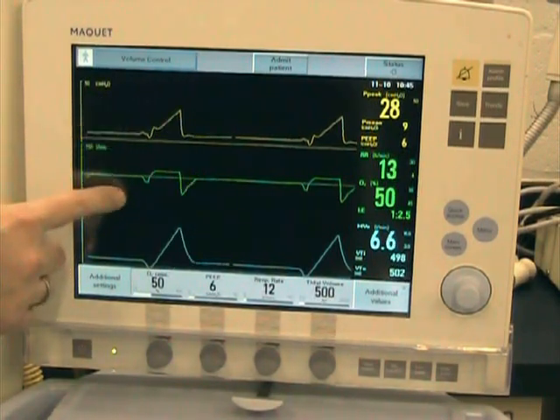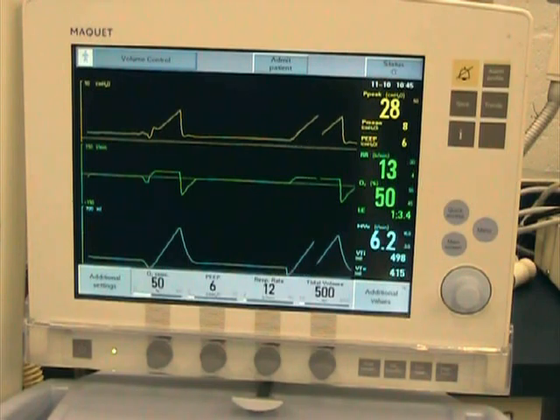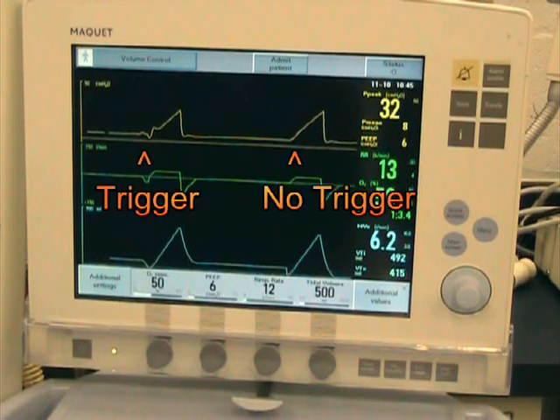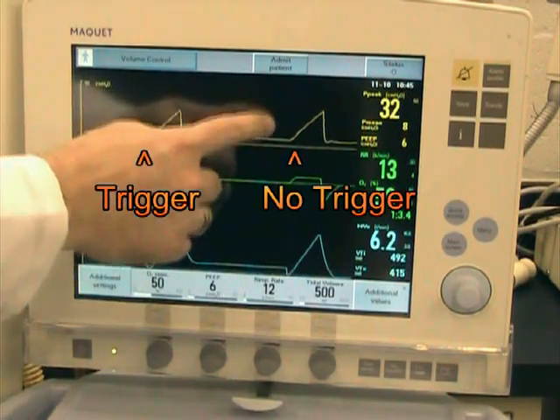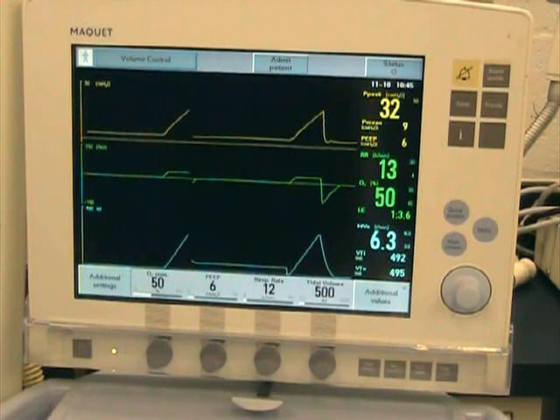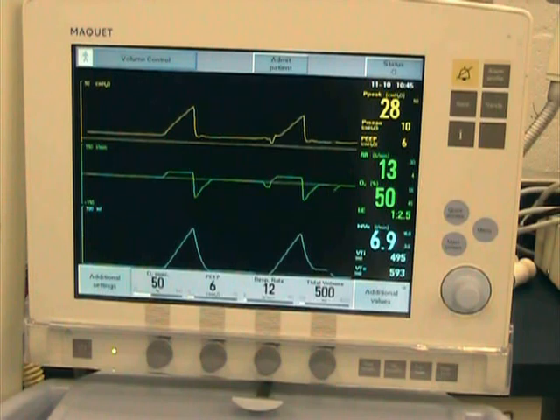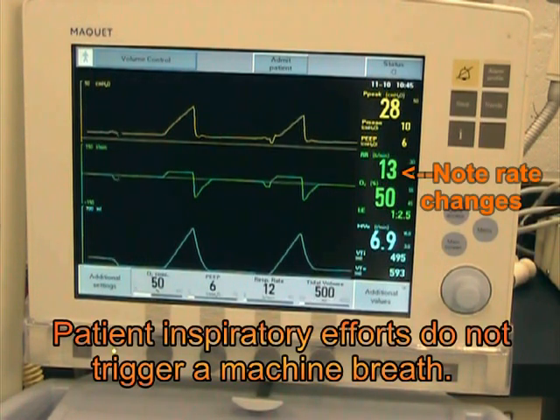The machine will respond to every patient breath. In this case the patient stopped breathing and fell back to sleep. If the patient starts breathing and is anxious and takes a lot of breaths in a row, the rate will increase.